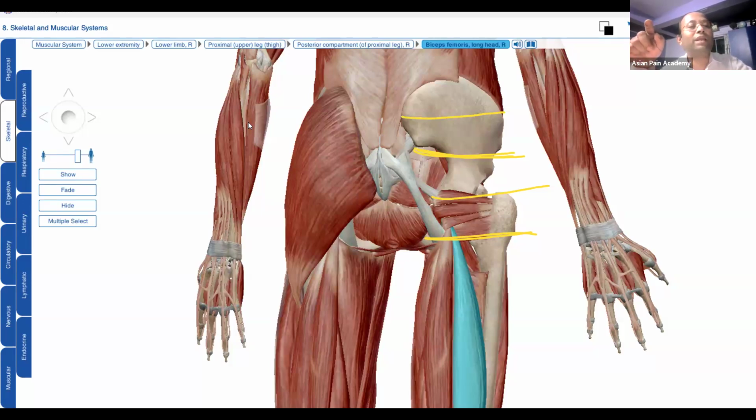So how do we understand at which area we are? We will see the bony margin. At area number 1, the bony margin will be like this. One side will be much superficial, and the lateral side will be a bit deep. So this area is actually a bit of a slope. When we demonstrate, I will show you this slope.